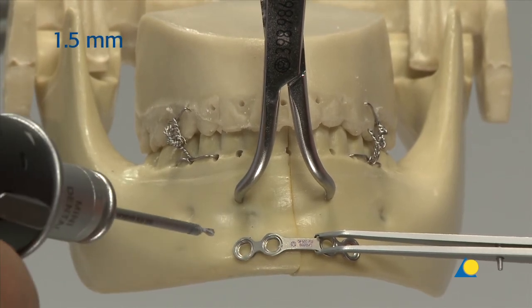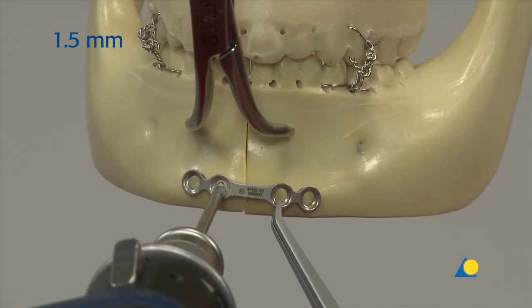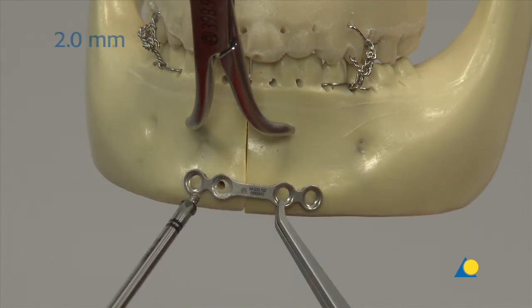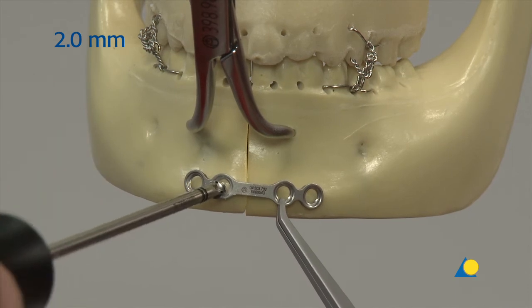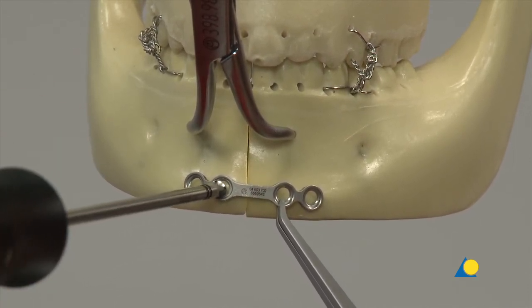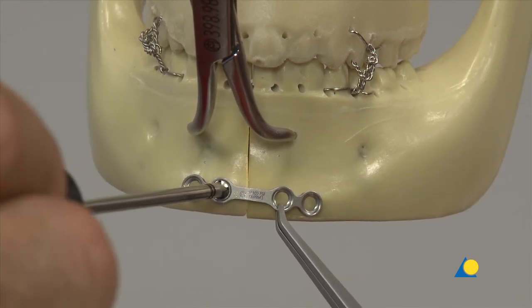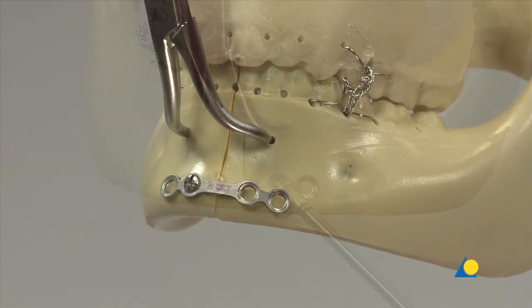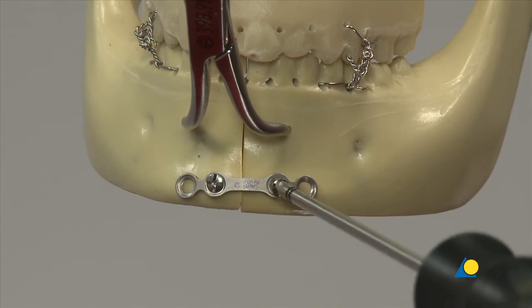A 1.5 mm drill bit with 6 mm stop is used to drill monocortically through the plate hole next to the fracture. A 2 mm screw, 6 mm in length, is inserted. However, it is not fully tightened until the final reduction and plate position are confirmed. A second screw is inserted on the other side of the fracture in the same way.